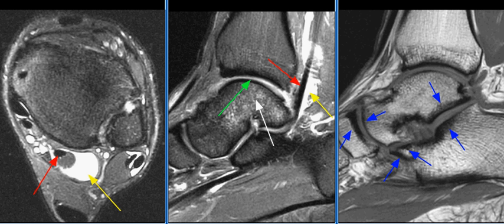There is bony sclerosis seen along the margins of the posterior subtalar, middle subtalar, talonavicular, and calcaneo-cuboid joints. This is a reactive change seen in jumping athletes like basketball players.